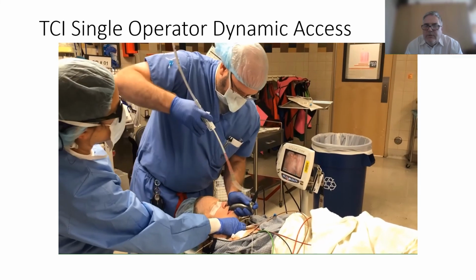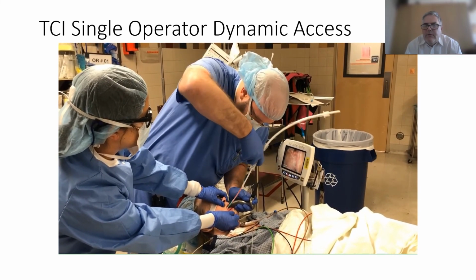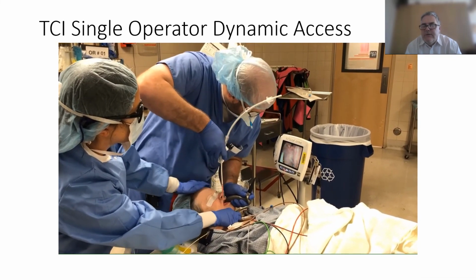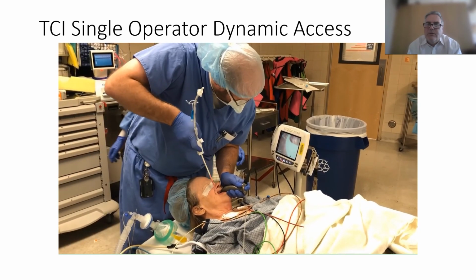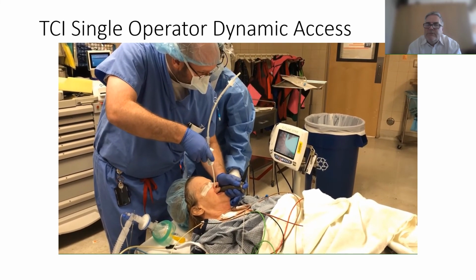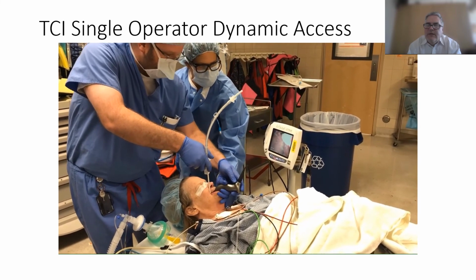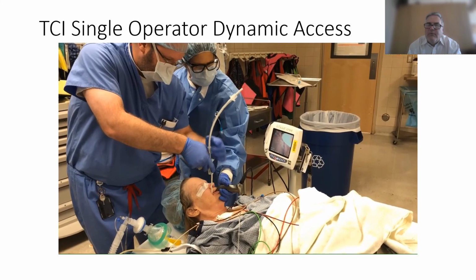This is a woman with fused neck and limited mouth opening. She's been intubated only with fiber optics in the past. She has juvenile rheumatoid arthritis. Visualization with the video laryngoscope, hyperangulated blade, primary curve solved, tip is articulated posteriorly, solving the inflection point without force, and then the secondary curve is navigated, all with a single operator.